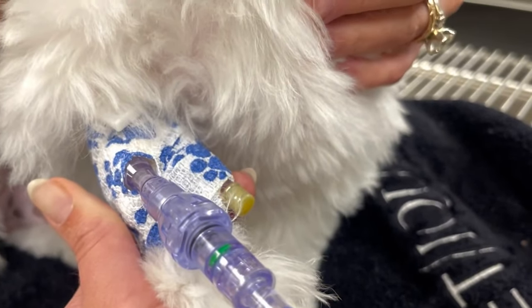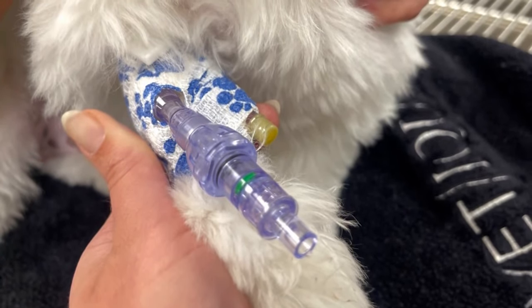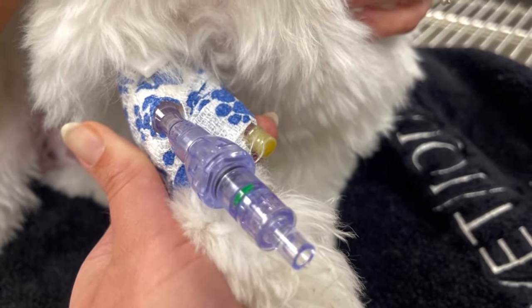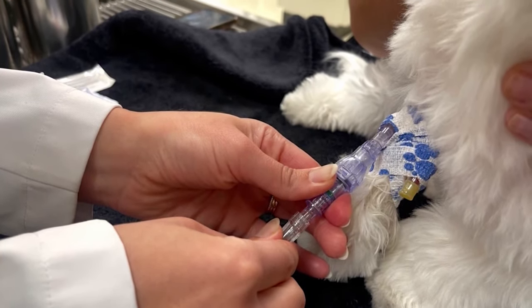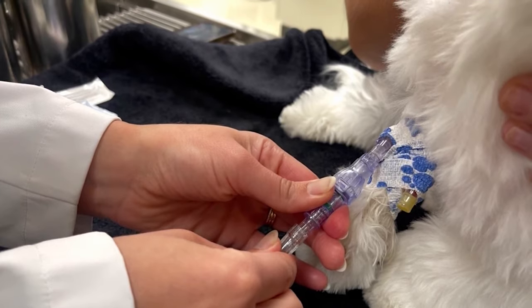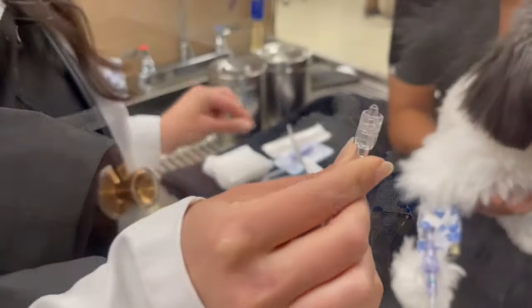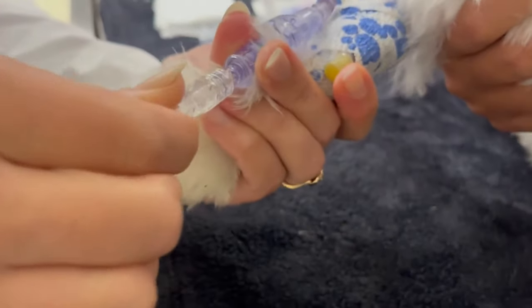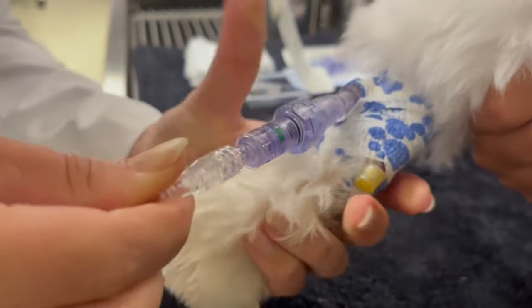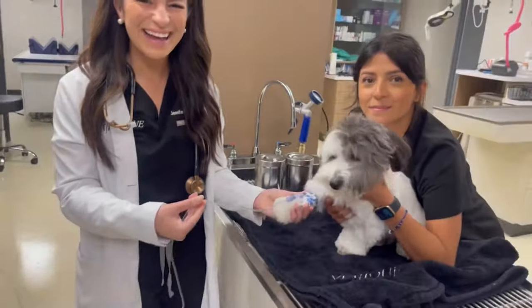The Break-Free IV Connector helps prevent restarts by a whopping 65%. So basically if the patient pulls the line out, the innovative recessed valves automatically close off and this keeps the line open safely. Think no bacteria in and no blood out for two hours. The Break-Free IV Set is equipped with an anti-reconnect feature that prevents contamination after separation, further enhancing patient safety and infection control protocols.